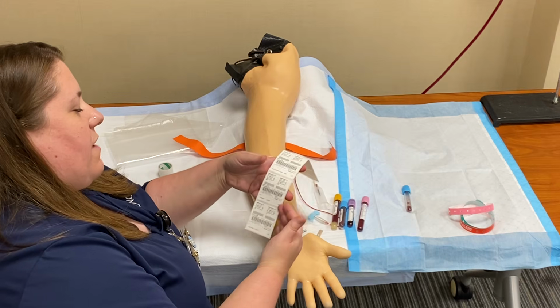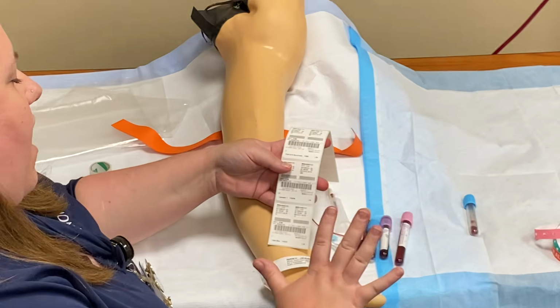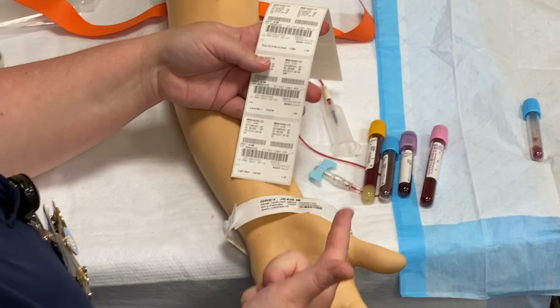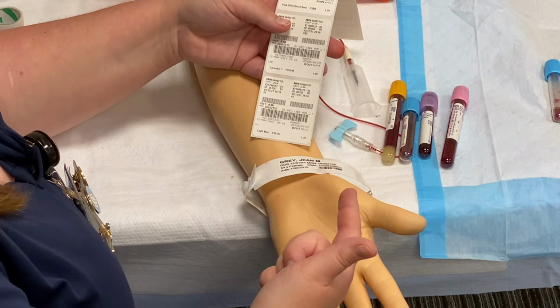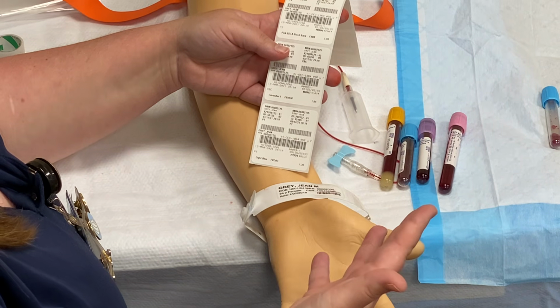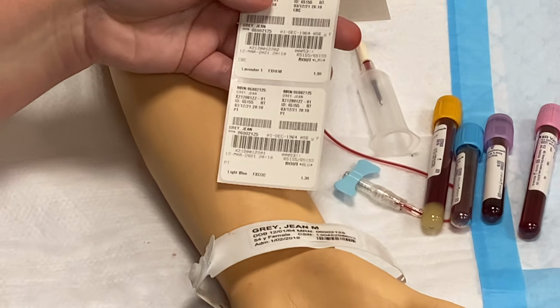Now, I have to bring my labels back to my patient because I need to check the Give Me 5. That's the patient's name, the final 4, the last 4 of the MRN, and I want to check to make sure my U number, today's date, and time of the draw are on these labels. So I'm going to do that for each of my labels.